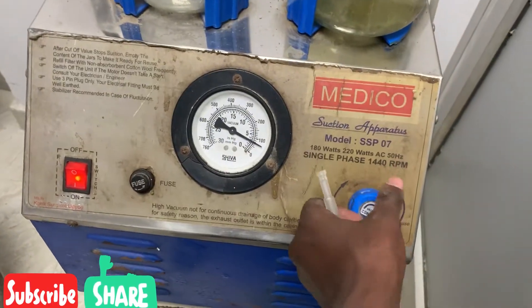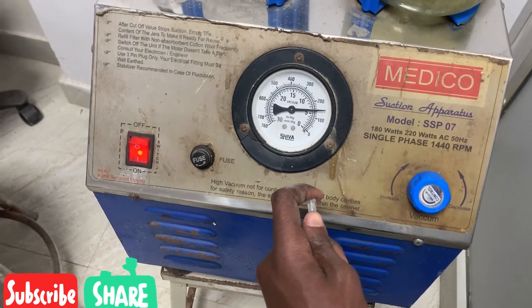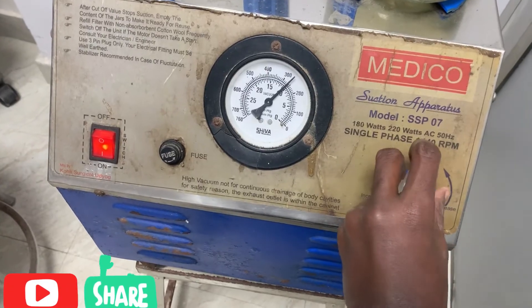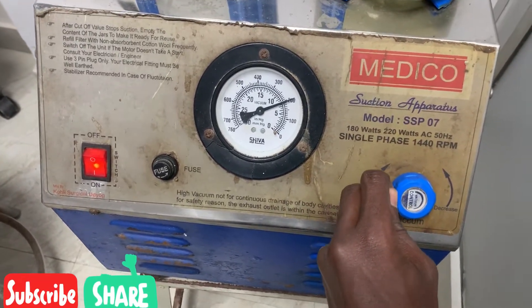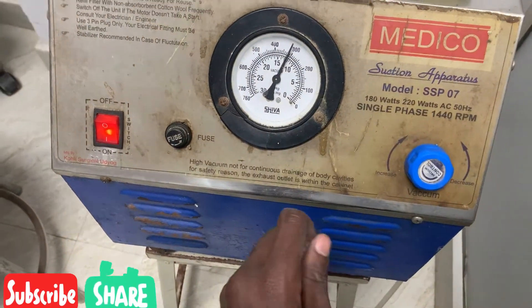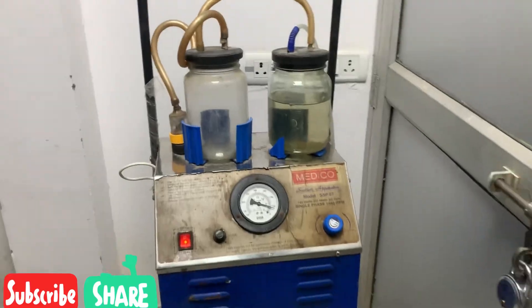For example, I want to decrease it. Let's say I want it to be at 200 — it's coming down to 200. Now I want to increase it to 300 — and you see it goes up to 300. So this is about this machine.